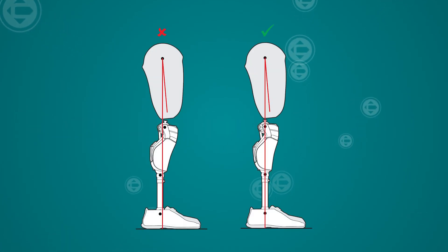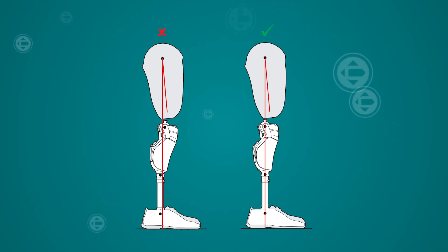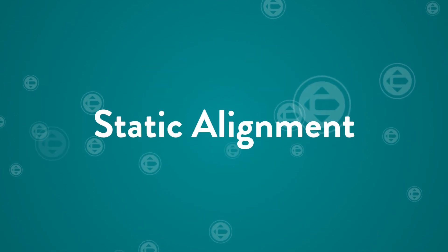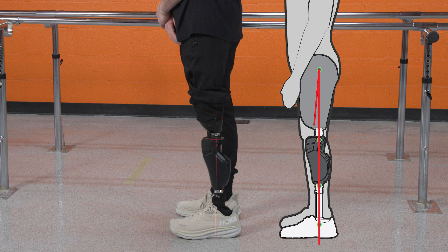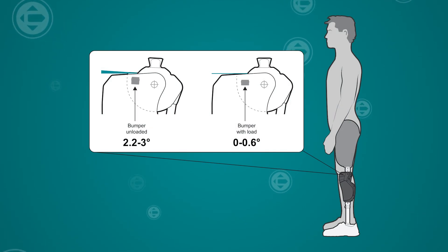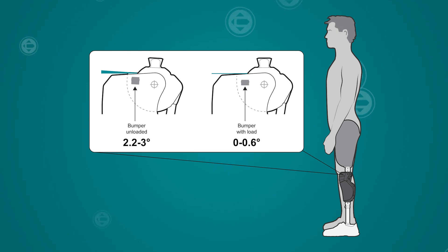When establishing bench alignment, ensure that the knee is vertical. The knee should not be tilting forward, which would allow the user to meet the forward tilt requirement too easily. During static alignment, the reference line should fall between 0 and 10 millimeters anterior to the knee center, and one-third heel to two-thirds toe lever of the foot. It is important to note the compression of the extension bumper at the knee as well. This bumper should be compressed so that the knee is meeting the full extension parameter.